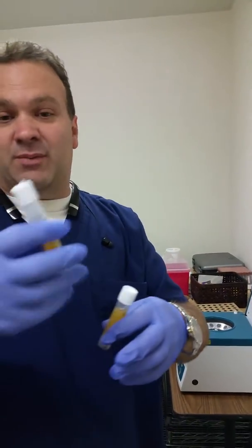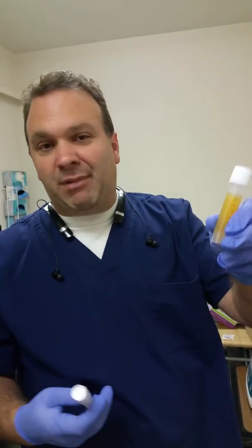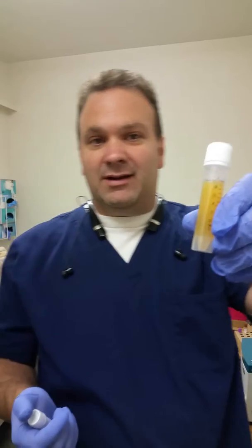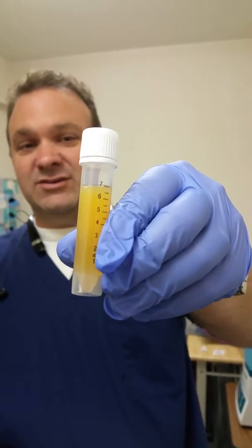And then you wrap them up with the little parafilm so it gets sealed up. I wanted to share this one with you — I won't share patient info, but if you want to take a look at this one.